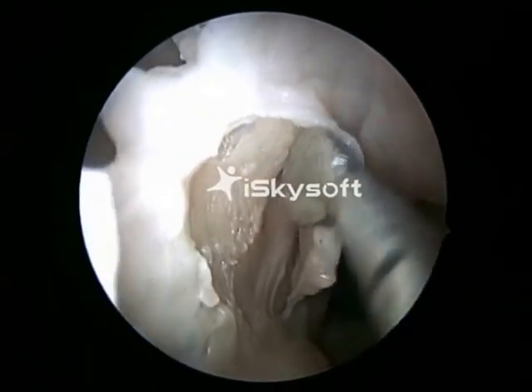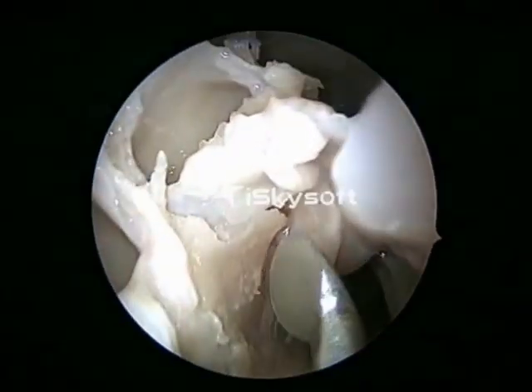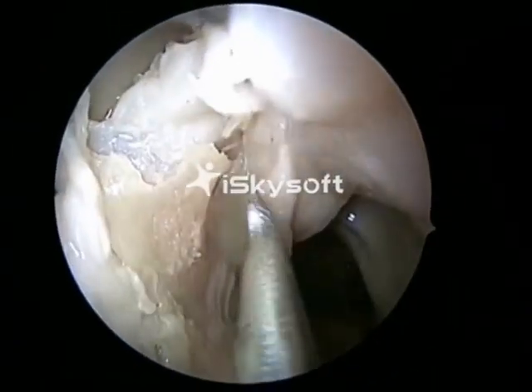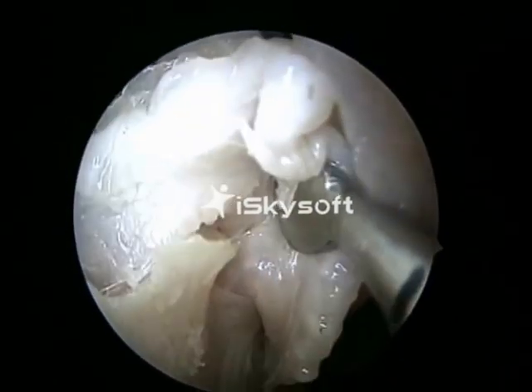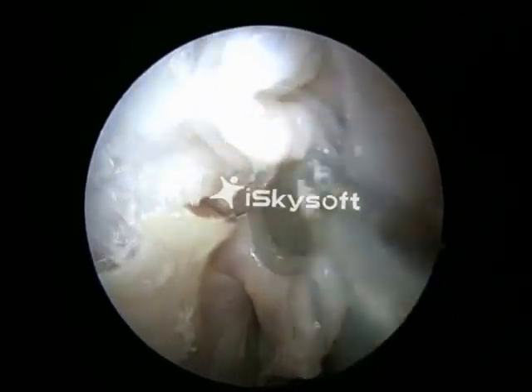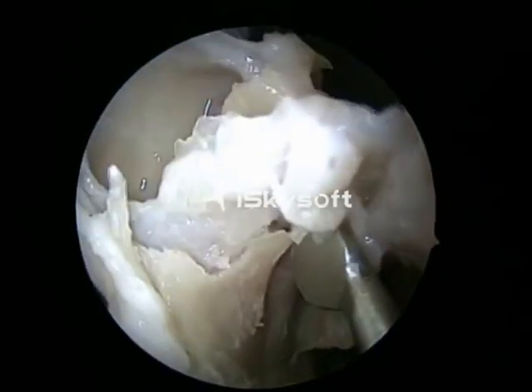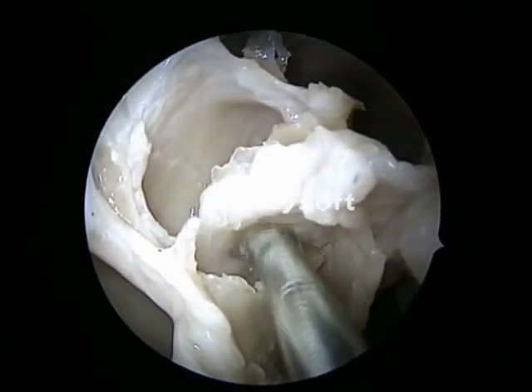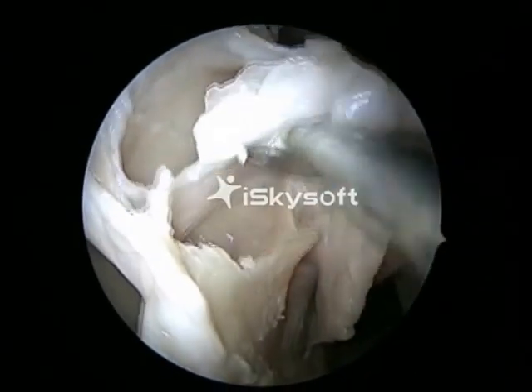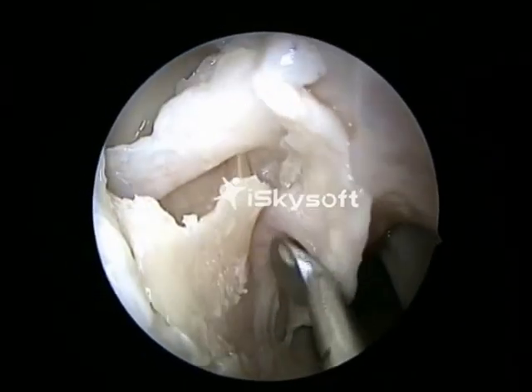Now we can see the crista ethmoidale very clearly. The crista ethmoidale is a bony ridge which forms the anterior boundary of the sphenopalatine foramen. You can see the crista very nicely there in your picture. That's in fact the mucosa of the Haller cell, which is going to be removed now.